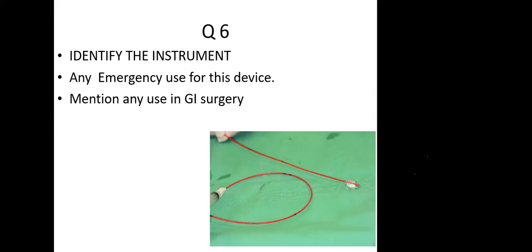has been an adequate perfusion at the bedside, or a very simple operation instrument? A handheld Doppler we can use to check. Sir, I do not have a handheld Doppler in my theater. I have to borrow it from my plastic surgeon colleague. Something that an anesthesiologist is using. So, a pulse oximeter to check the saturation of the toes. Pulse oximeter, isn't it? Okay.